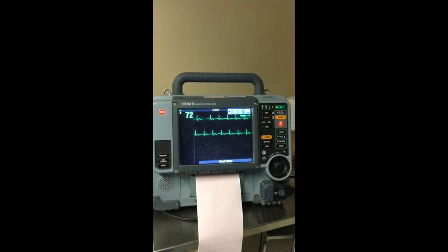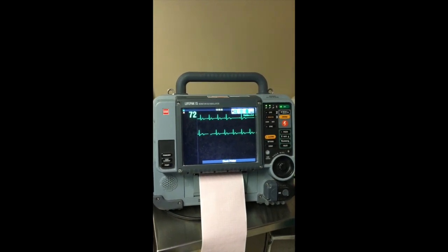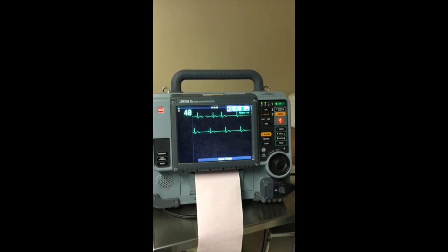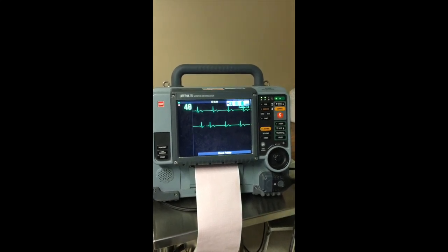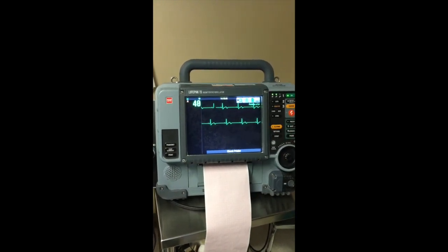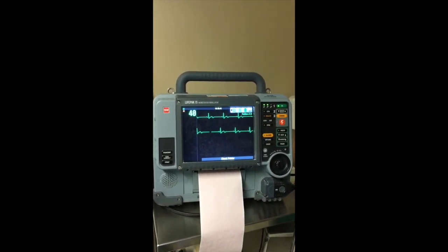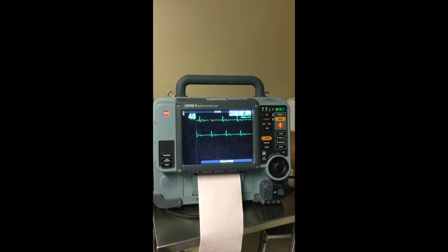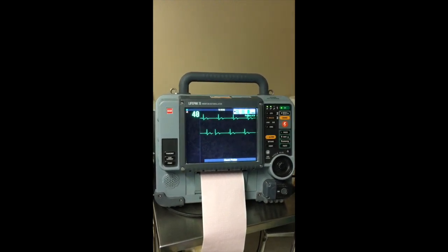But let's say the patient was in this rhythm. So that rhythm is sinus Brady. Right. So say the patient was, we're talking about an adult patient here, or for you guys, if it was a PD patient, a rate of 40 is too low, obviously, and they're symptomatic. Mechanically, what could we do for someone that is in a Brady rhythm? I know you need to pace somebody that is in a Brady rhythm that is symptomatic.